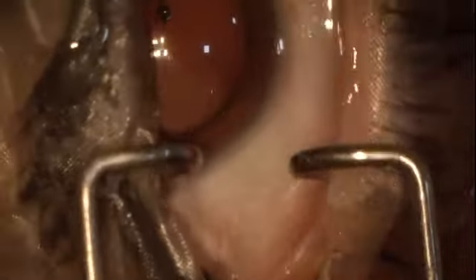Now, the implantable contact lens has a specialized system for the placement of the ICL inside the eye. They have this cartridge; fill it with balanced salt solution and place some viscoelastic. With the help of a soft-tipped applicator, remove the ICL from the bottle and place it inside the cartridge. Make sure that you orient it properly. The convex part faces the corneal endothelium.